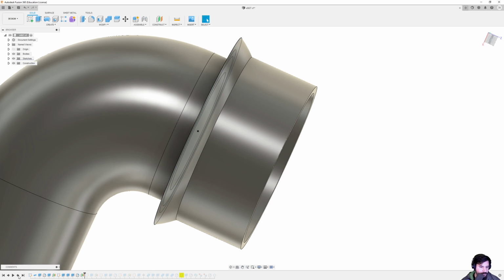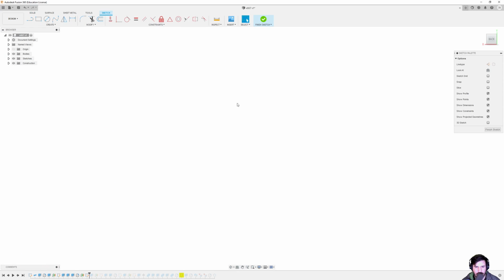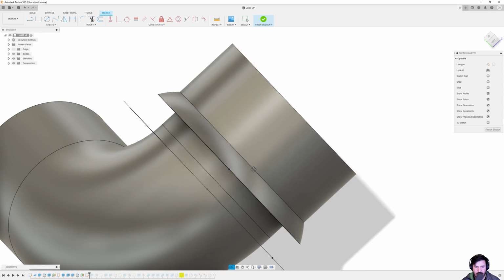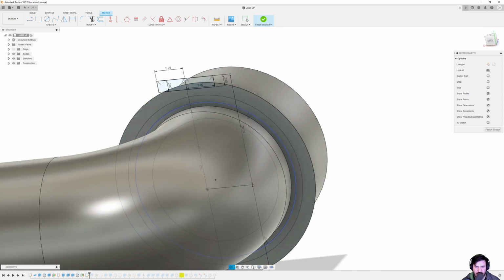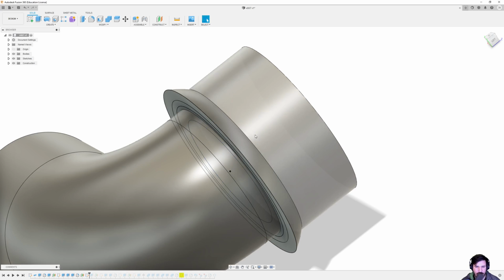So I made another offset plane. You can see it's on the inside. And what did I add there? Let's see. So I made an offset plane a little bit further back. I don't know why. Yeah, I know why I did it this way. I made it back here, and I made these squares here, and those were the start of the actual clasps that I ended up with. I ended up making them really far back, and I moved them forward, and you'll see that in a bit.